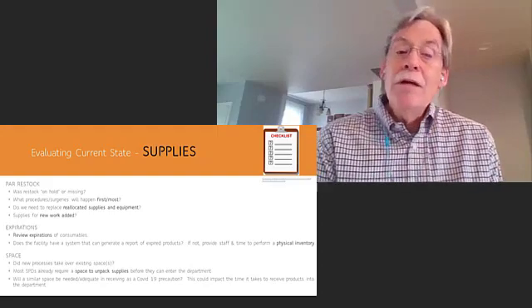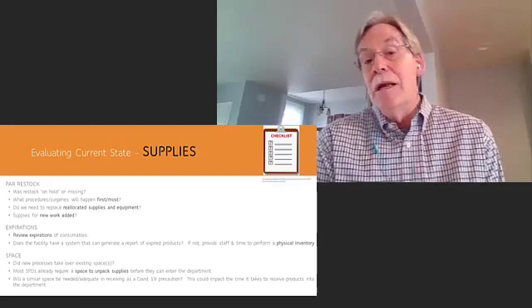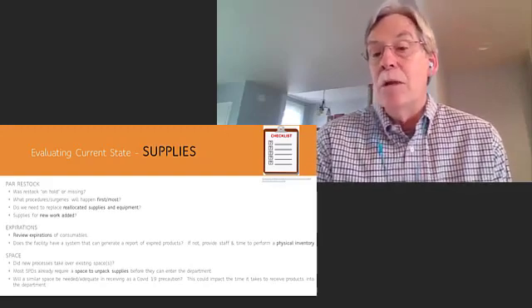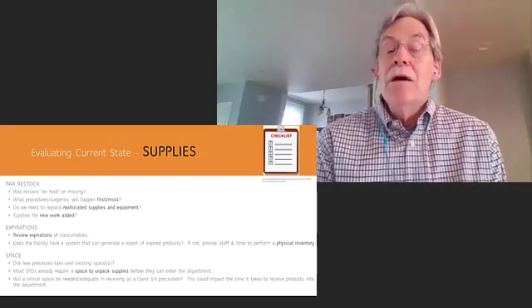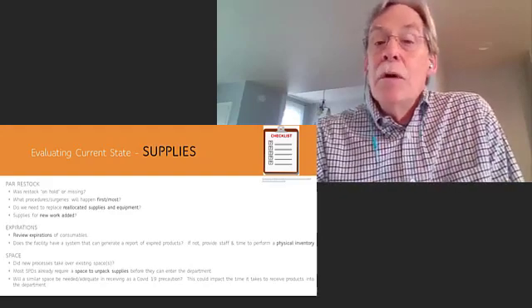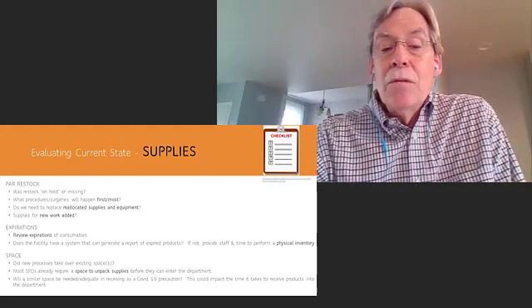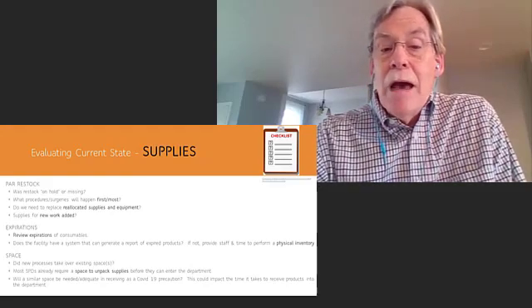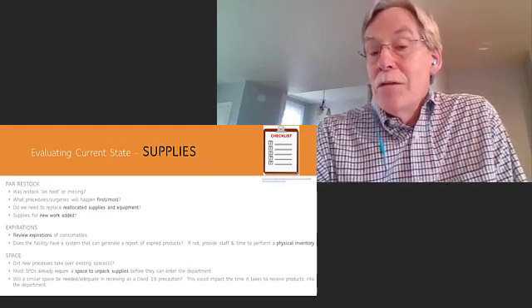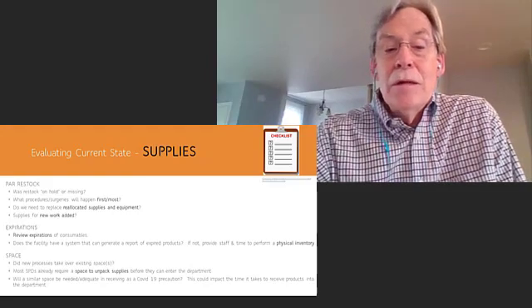If your department has now taken on the role of reprocessing N95 masks, you're going to need to incorporate those related supplies into your master list. Consumable supplies may have expired during the downtime. So as we mentioned, available space for supplies may be different now also. If new processes were added, this may have taken over existing supply spaces. Do you still have the appropriate and adequate space that you need to store supplies?